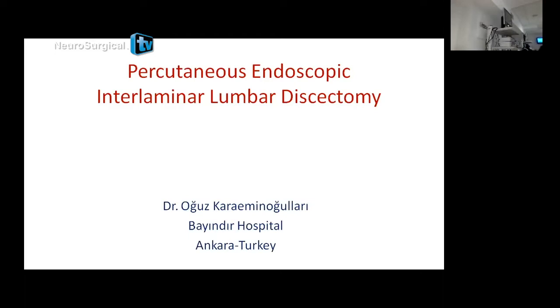So the main difference in the technique I am using is that I go like this. I can draw it here. In the vision, this PLL should be in the lower part of the vision. So if you take it, it doesn't matter, you are always epidural. This is the philosophy of the epidural technique.